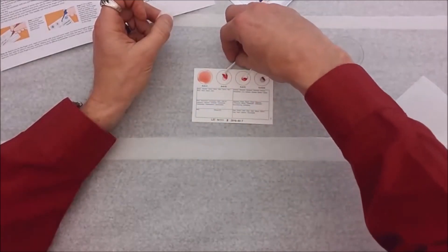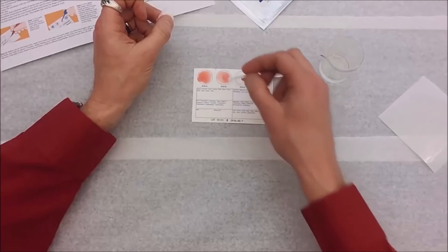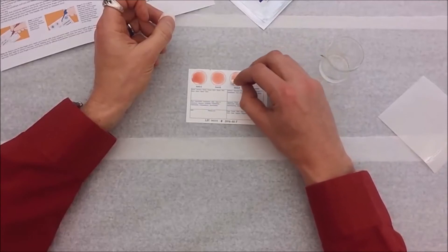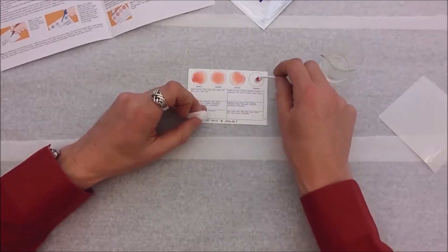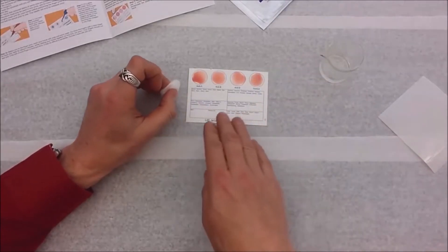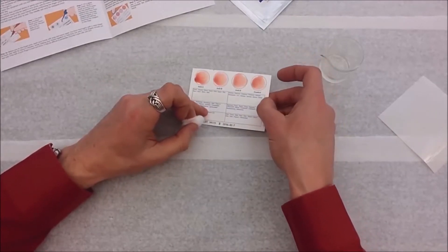The next thing to do is pick up each spatula in turn, stir up the sample, and spread it out in that circle for ten seconds, then toss the spatula. Do that for each of the four circles — stir for ten seconds each, making sure to stabilize the card as you go. Now we're done with that mixing.